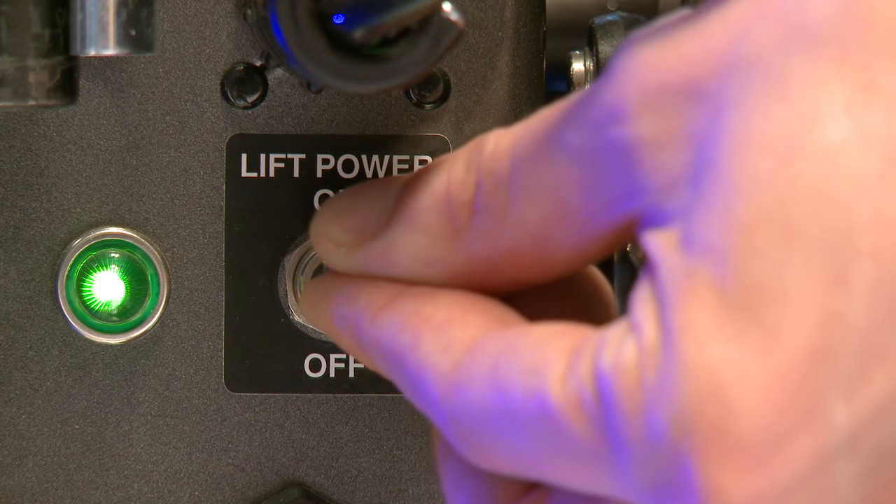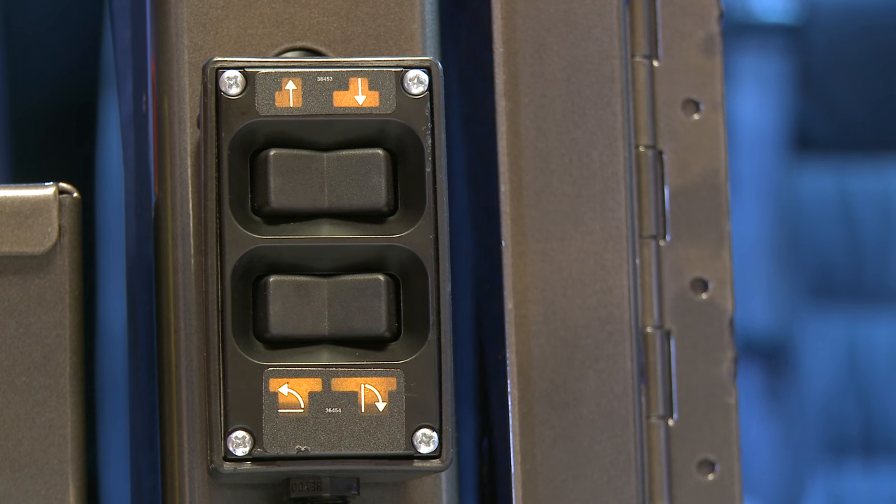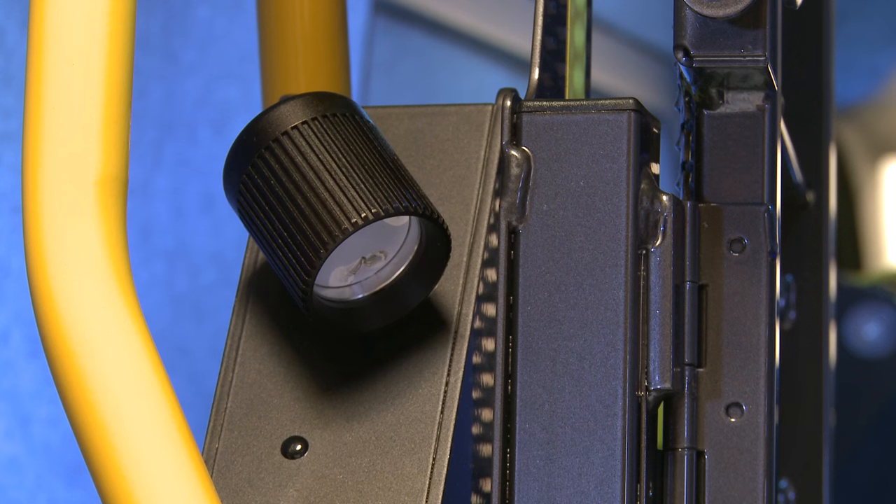Turn the power on by using the switch on the lift. This will turn on the handset and the platform illumination lights.